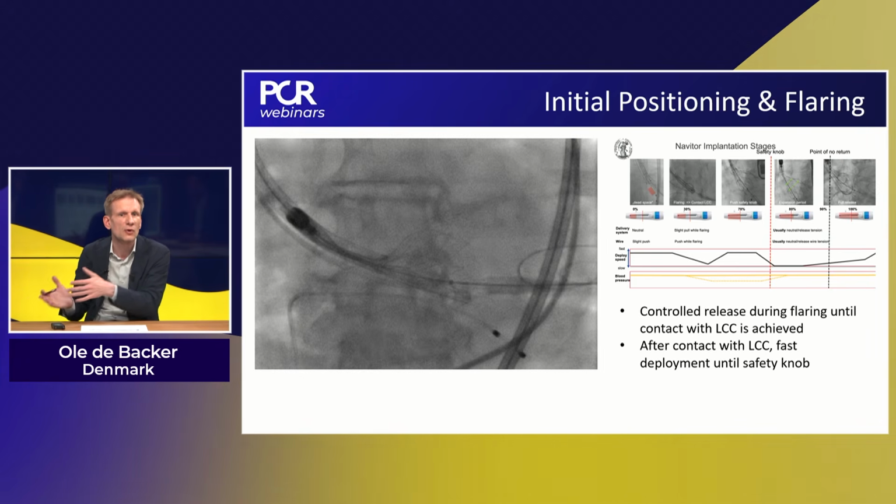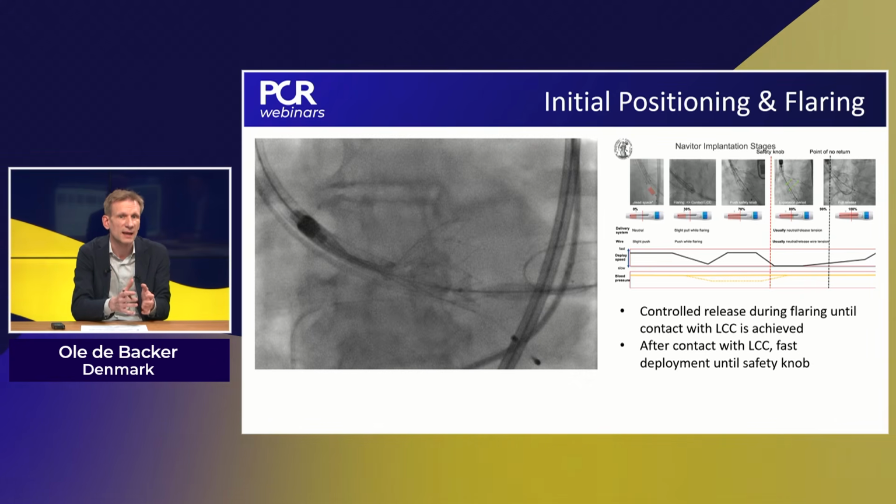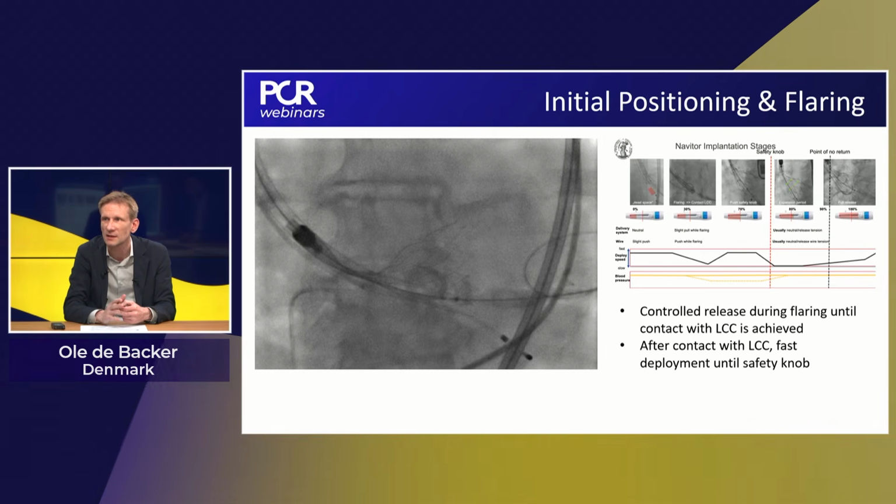If you want to stick absolutely to cusp overlap, I think that would have maybe been even a mistake. I think you should go out of that, maybe go tricuspid or even a little bit LAO and correct for your parallax, and then you can see this, yes? What do you think? Do you agree on that?